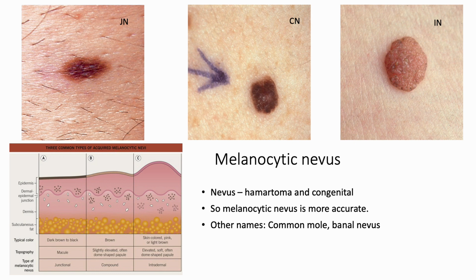And here is the demonstration of the melanocytic nevus. The left one indicates the melanocytes. They are forming nests. Nests of melanocytes are a feature to tell them apart from the lentigo. Remember, the lentigo does not have nests. Melanocytic nevus has nests. And if the nests only exist in the dermal-epidermal junction or only in the epidermis, we call this a junctional nevus, which usually presents as a dark brown or black macule.